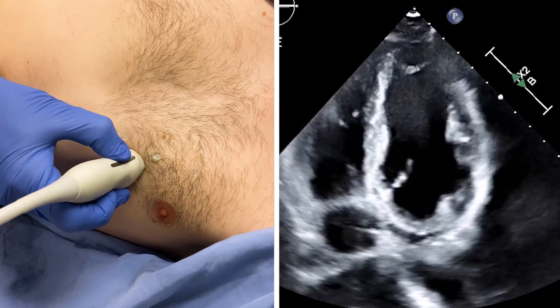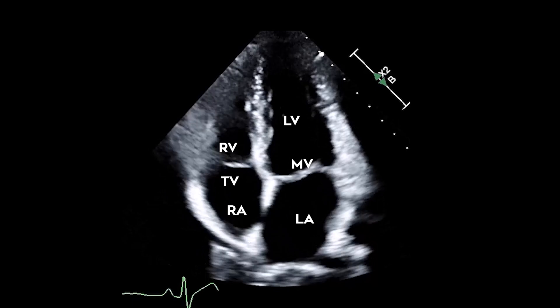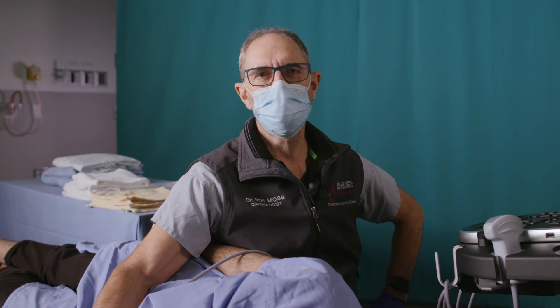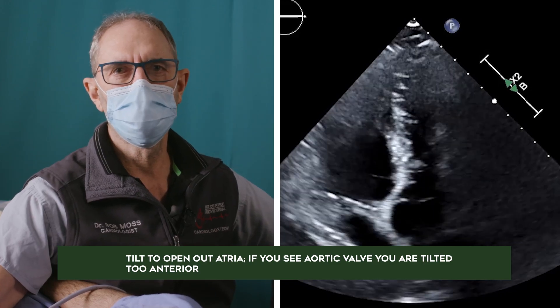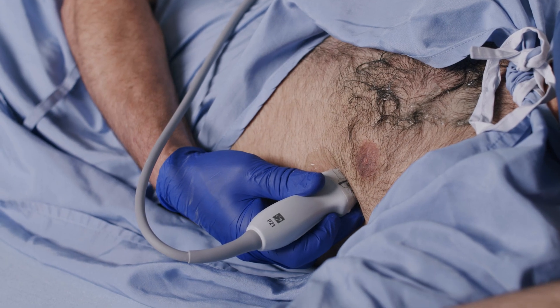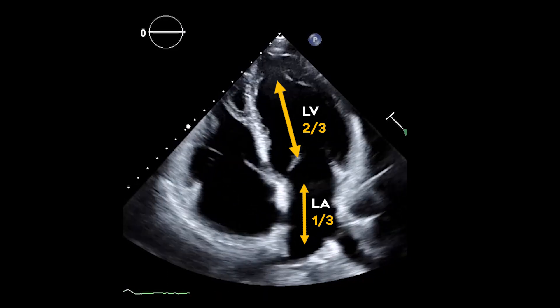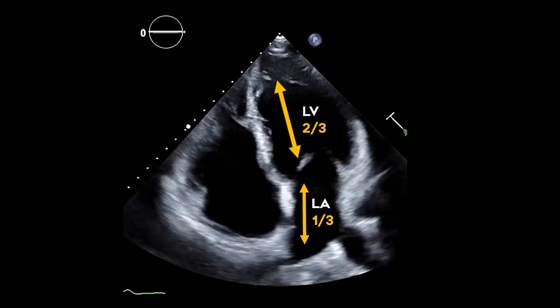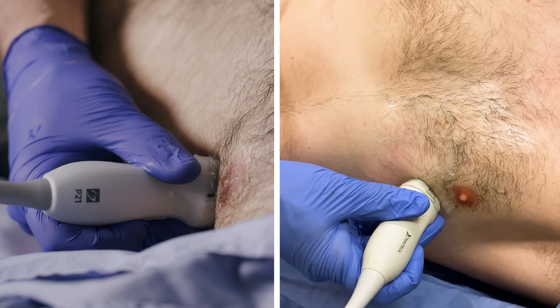Rotate the probe to open out both ventricles so that they appear at their widest. Adjust the depth to ensure that all four chambers are displayed. If you don't see enough atria, tilt anteriorly — but if you tilt too far, you will see the aortic root, the so-called five-chamber view. Usually two-thirds of the length of the heart is occupied by the left ventricle and one-third by the left atrium. If the atria are too long in relation to the left ventricle, you have probably foreshortened the image. The correction is to slide to a lower, more caudal interspace.